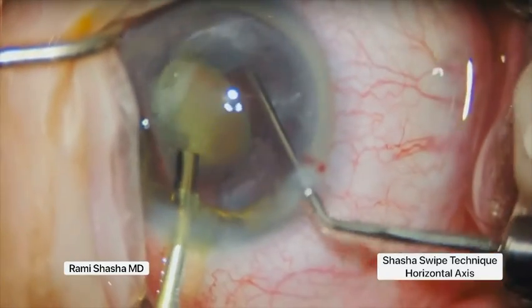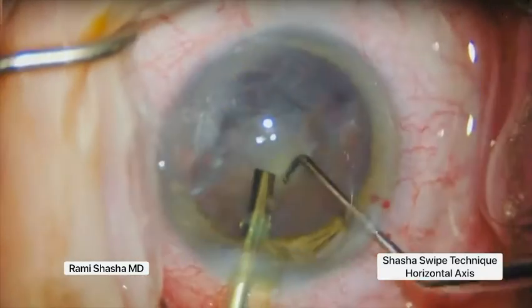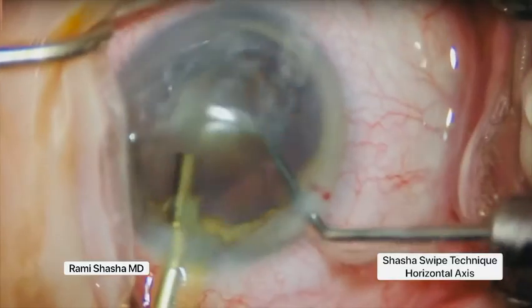This technique works on soft, dense, and extremely dense cataracts, as it utilizes mechanical forces.